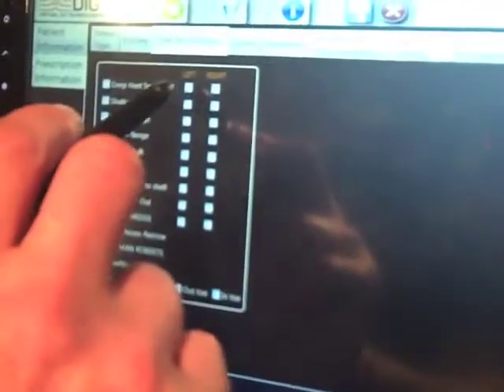We can add all the typical shell modifications — if the doctor wants a deep heel seat on the left and right, we want to put a medial flange — all of these things are available. We can select from any range of top covers; we want to put an eighth-inch top cover, let's say. Extensions for the toes if I want to put those, all the various paddings and modifications. And of course I can send special instructions to the laboratory if I just want to send a note to the lab.